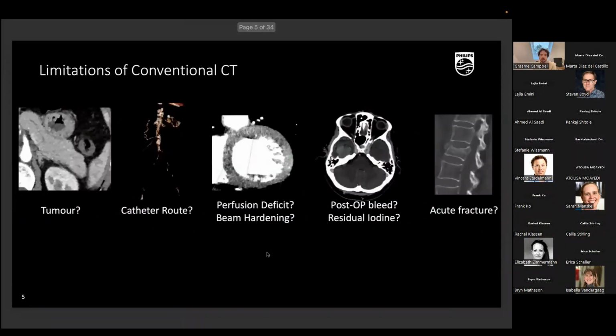So now there's a lot of uncertainty that I touched on. And for example, you might have, you're looking at a CT scan and you're not really sure, is there something there? There might be something hyperdense, but it's very difficult to tell. Or maybe you see something, but you don't really know quite what it is.